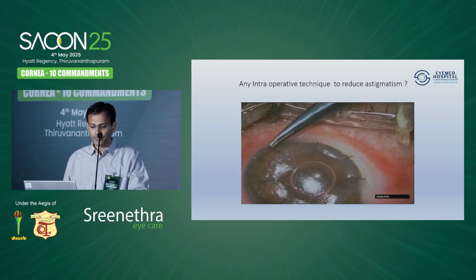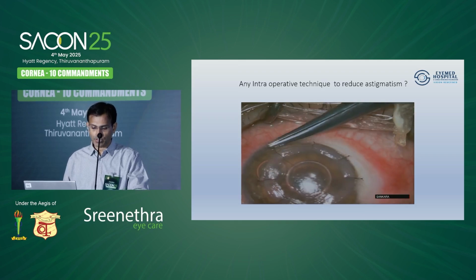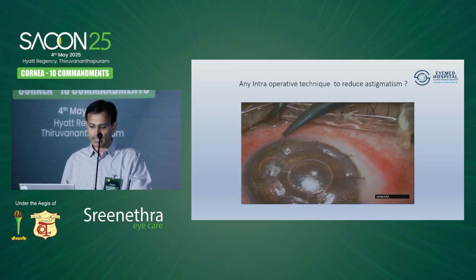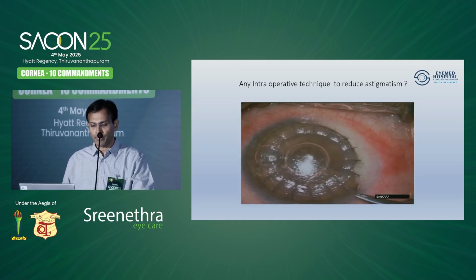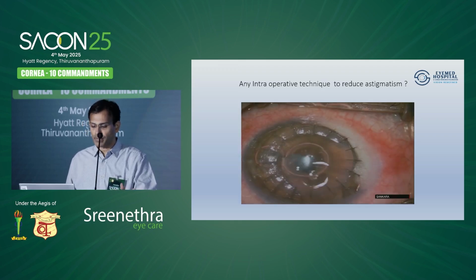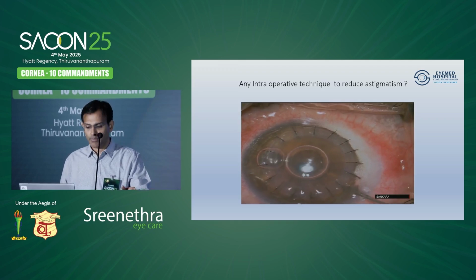So what I do, I tighten it according to the apposition. Once it is opposed, I know it is opposed, then I tighten it and go along the curve, so that the astigmatism is less. So usually I make it a little bit flat. My aim is, when the patient post-operatively, immediately if I'm able to see well, I'm unhappy. The patient should say, I'm not seeing well.